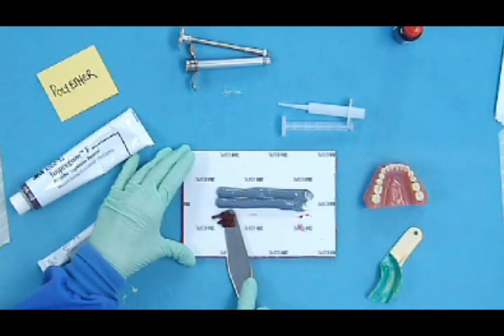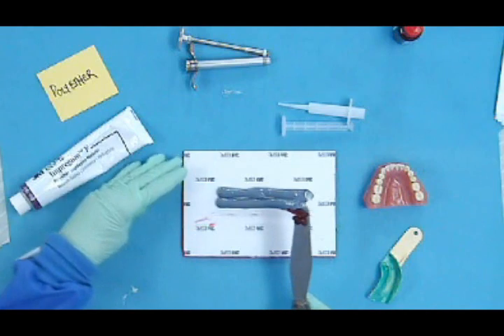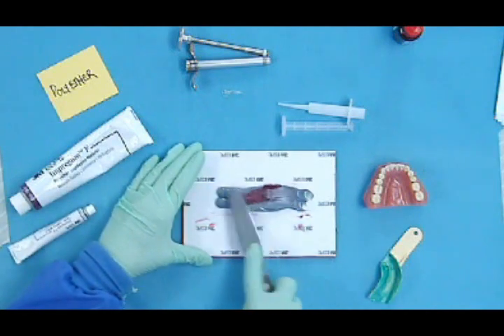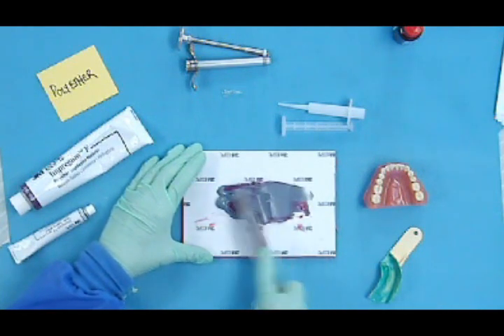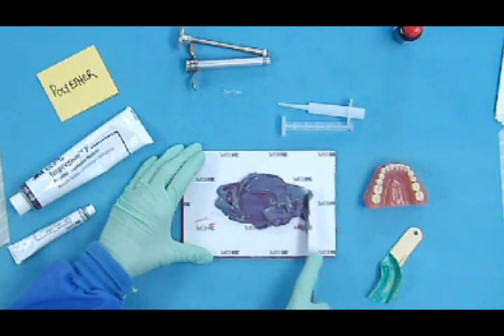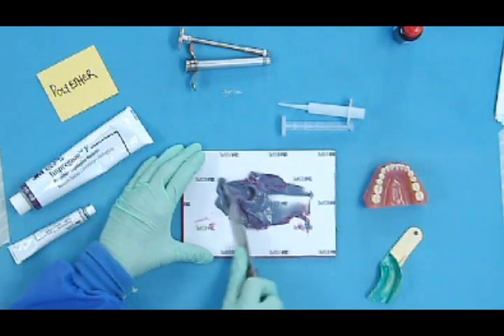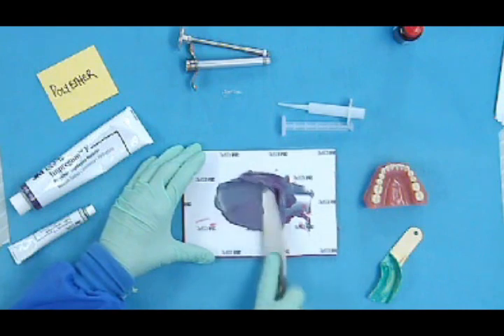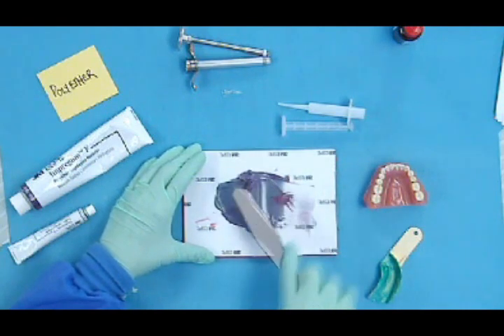And just as before, we're going to put all the catalyst on the spatula first and then mix it into the base. Try to keep all of these materials, when you mix a material like this, try to keep it all on one side of the spatula.